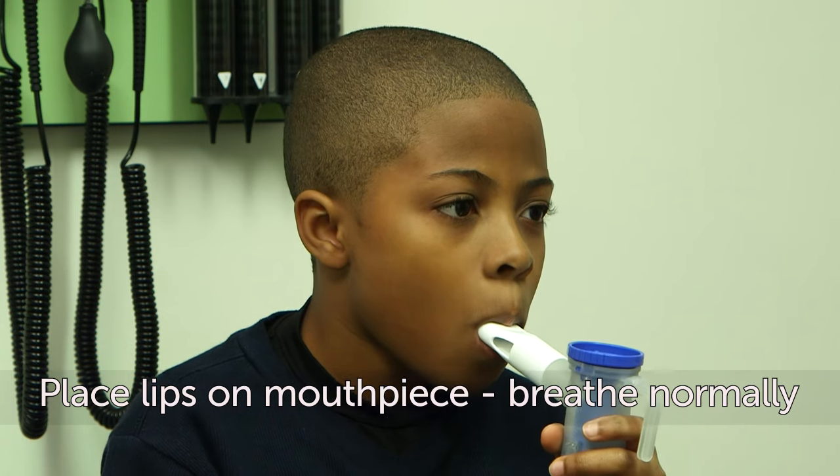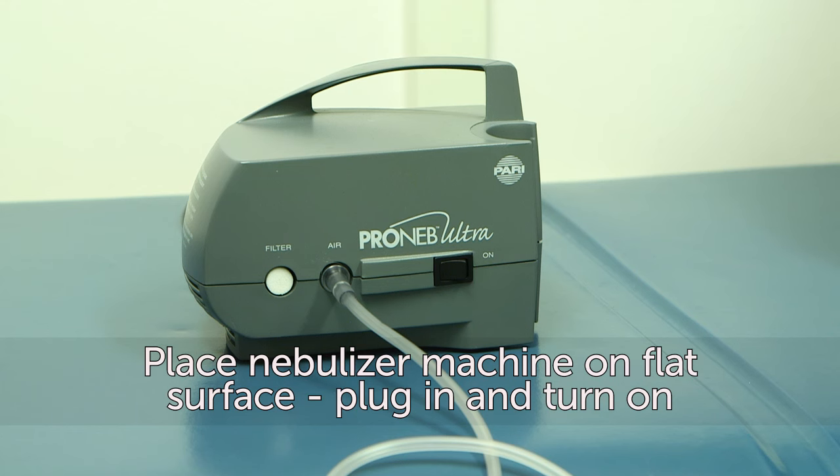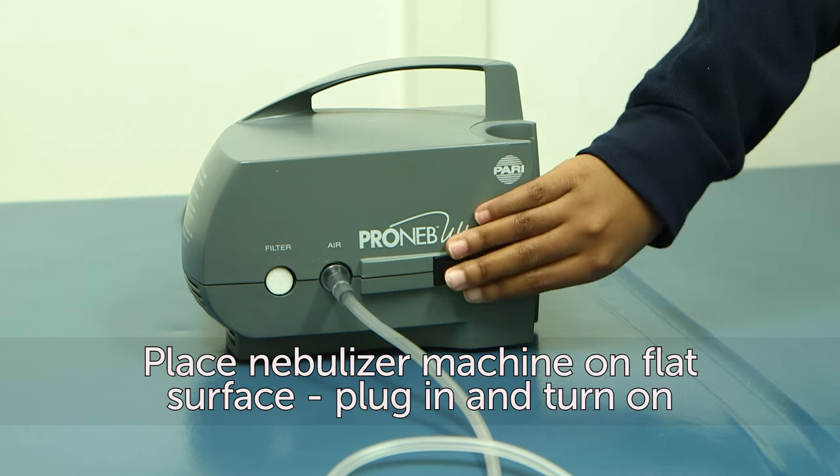Put your lips on the mouthpiece and breathe normally. Make sure the nebulizer machine is placed on a flat, steady surface and plugged into an outlet. Turn on the machine.